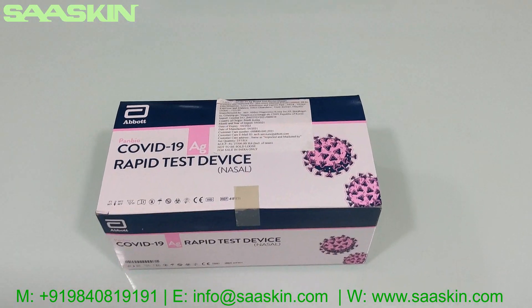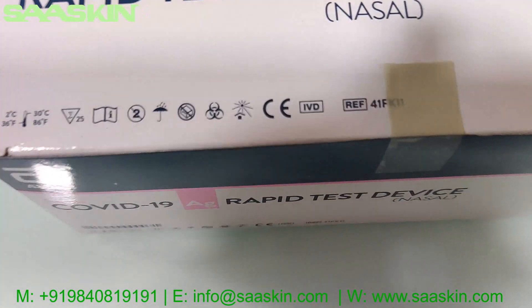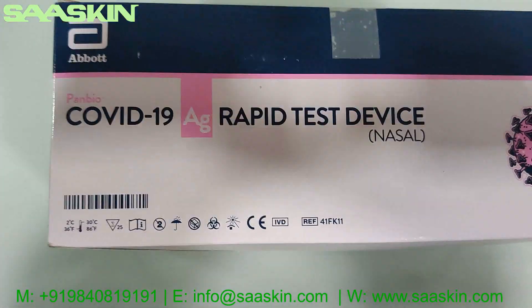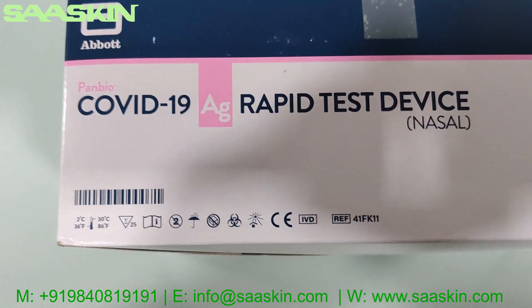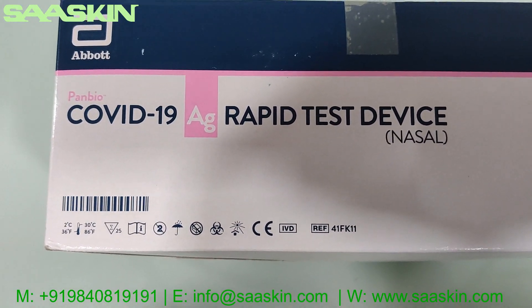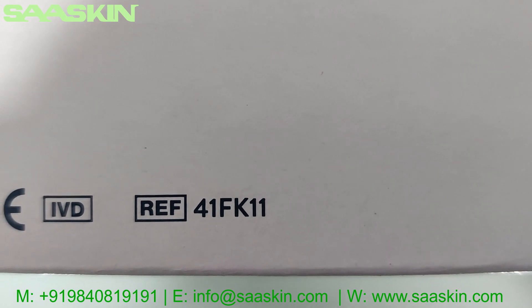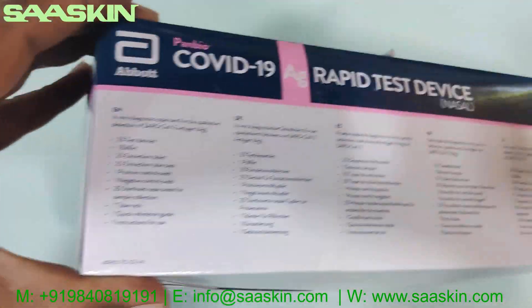Today we are going to look at the COVID-19 antigen rapid test device from ABOT. This device is CE certified and WHO approved. It's called the ABOT Panbio COVID-19 antigen rapid test device, nasal type. The part number is 41FK11.